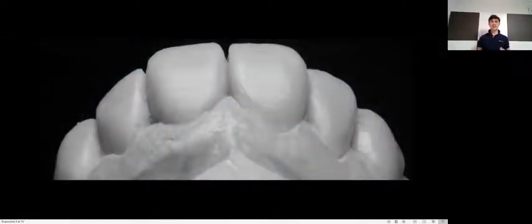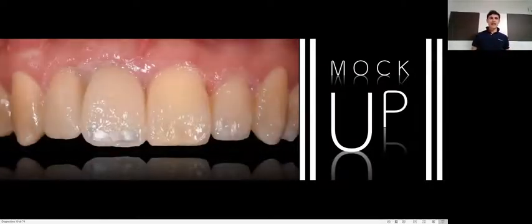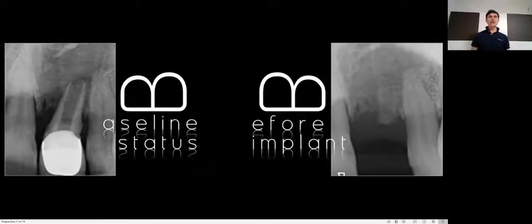After the first impression, we provided dental waxes in order to create a pre-visualization of her smile by means of a mock-up, and give her the chance to pre-visualize her future smile, so she can easily know exactly what she can do and which kind of procedure and steps she needs to follow to reach that goal.